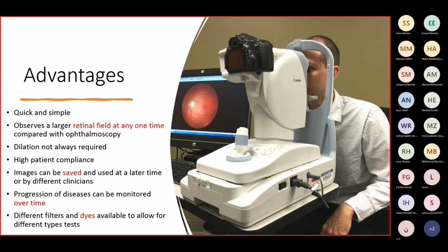The advantages of the fundus camera: it's quick and simple, and it can give a large retinal field in a single shot. High patient compliance. The image can be saved for follow-ups, and you can use dyes like indocyanine or fluorescein to do the angiography.